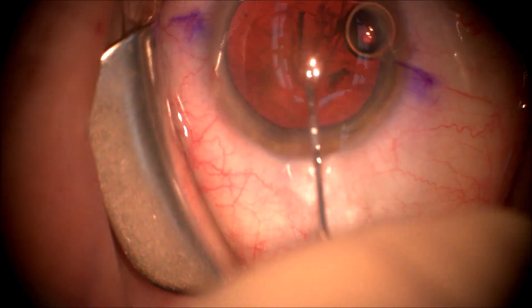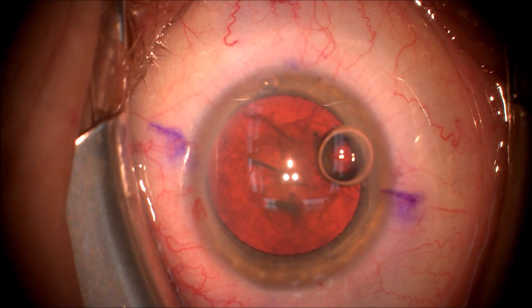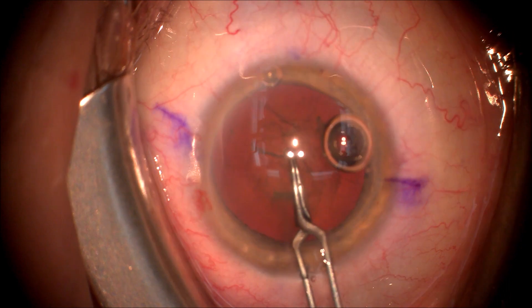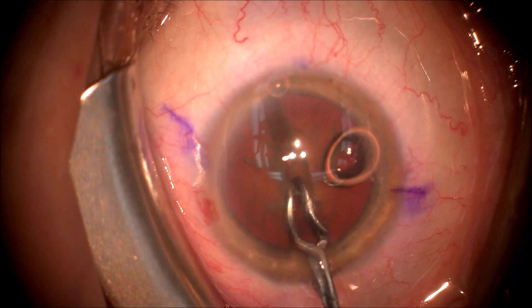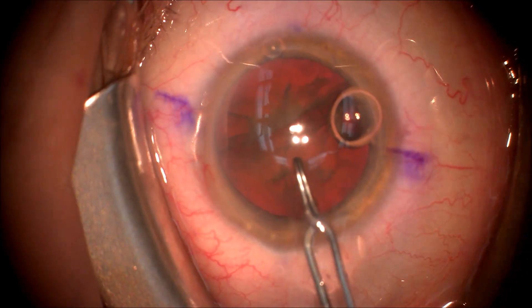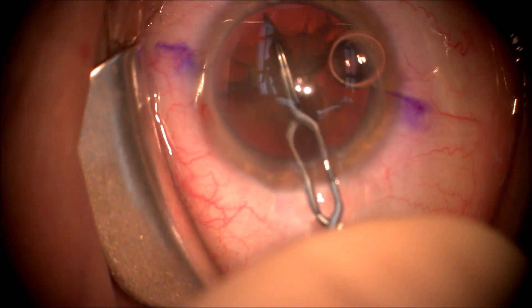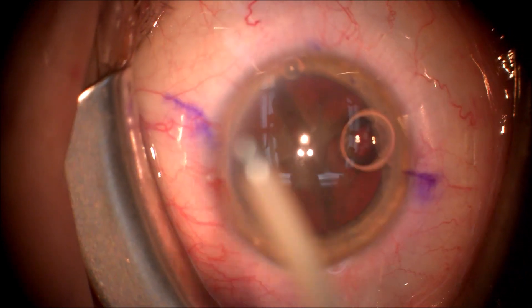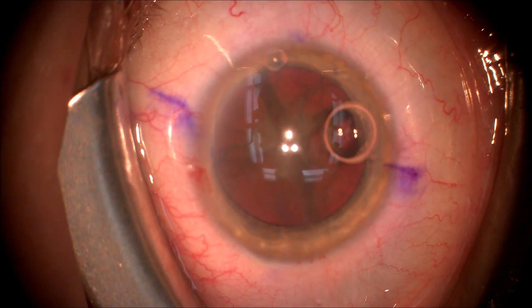We've completed hydrodissection with balanced salt solution to free up the cataract. We're going to use an Akkohoshi pre-chopper to break the cataract into four pieces — we've broken it successfully into two pieces and will break it into a further two pieces to give four quadrants. It's necessary to break the cataract into quadrants to remove it through the four-and-a-half millimeter opening of the anterior capsule we've just made.